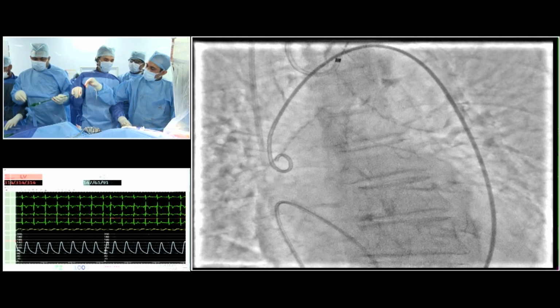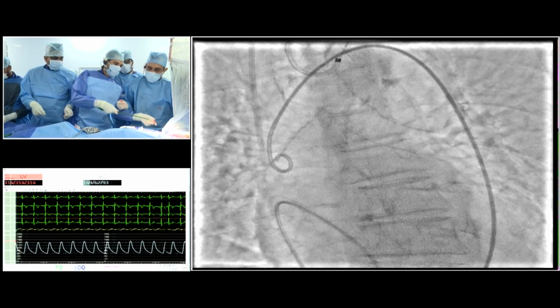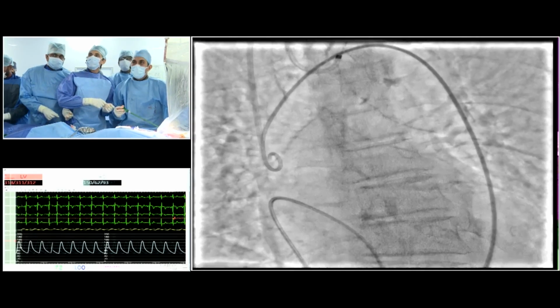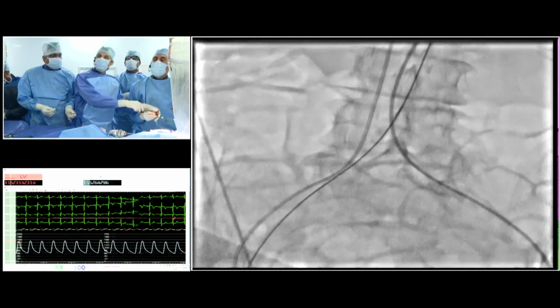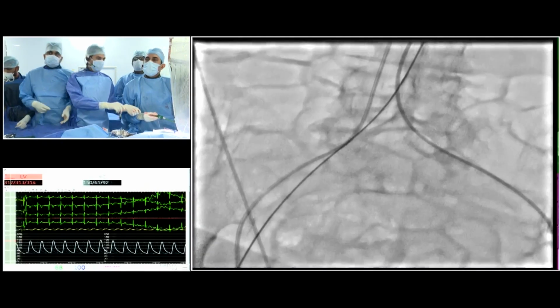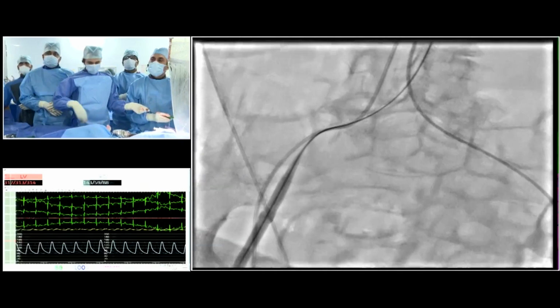So, Dr. A.B. Mehta and Professor Serious, the question which I wanted to discuss is 20 versus 21.5. We have decided to use a 20 valve because, looking at the age, the body surface area is just 1.14. Number one, and number two, coronary protection versus no coronary protection with a guide and a stent.